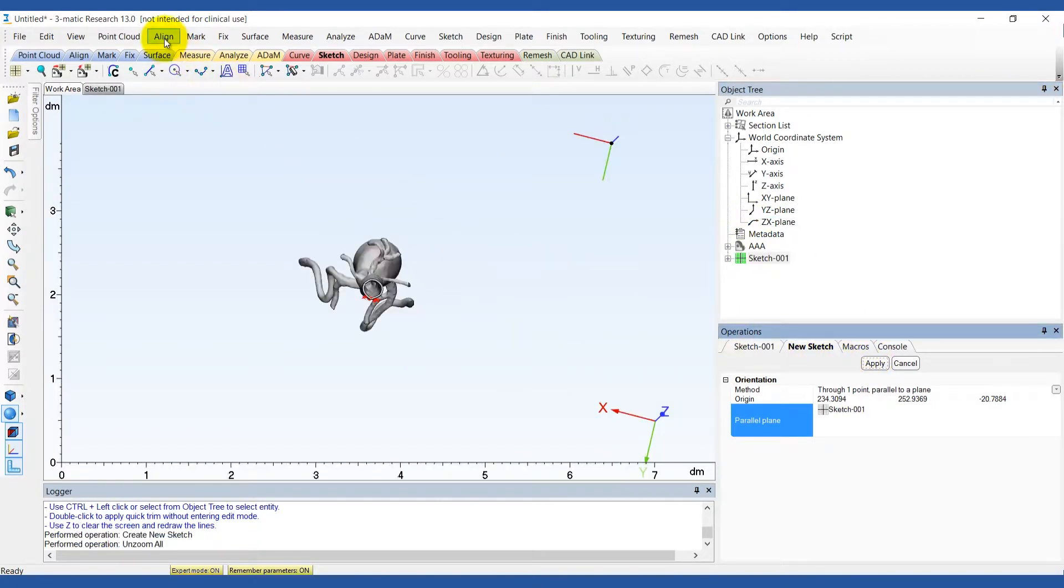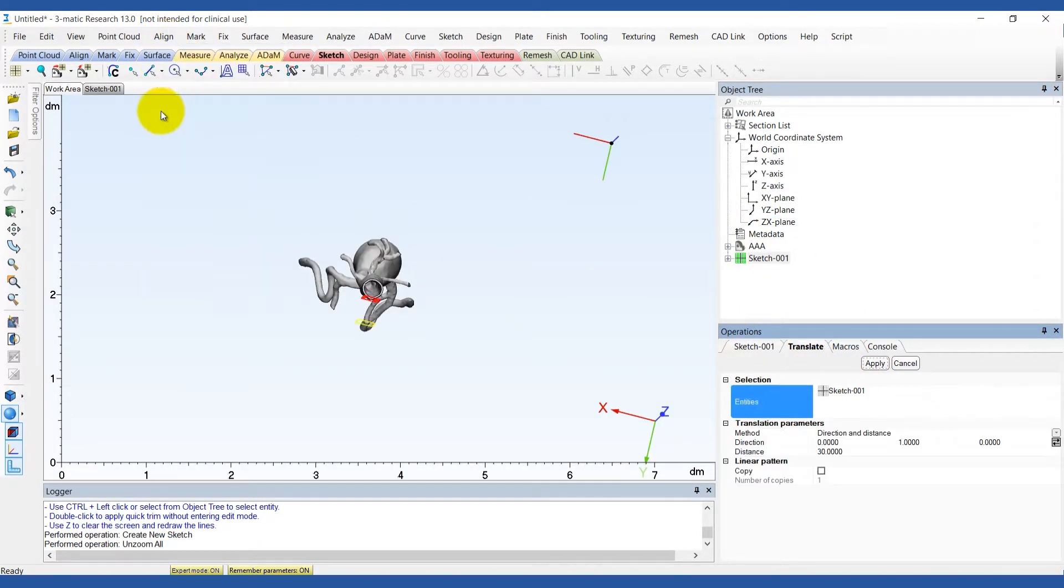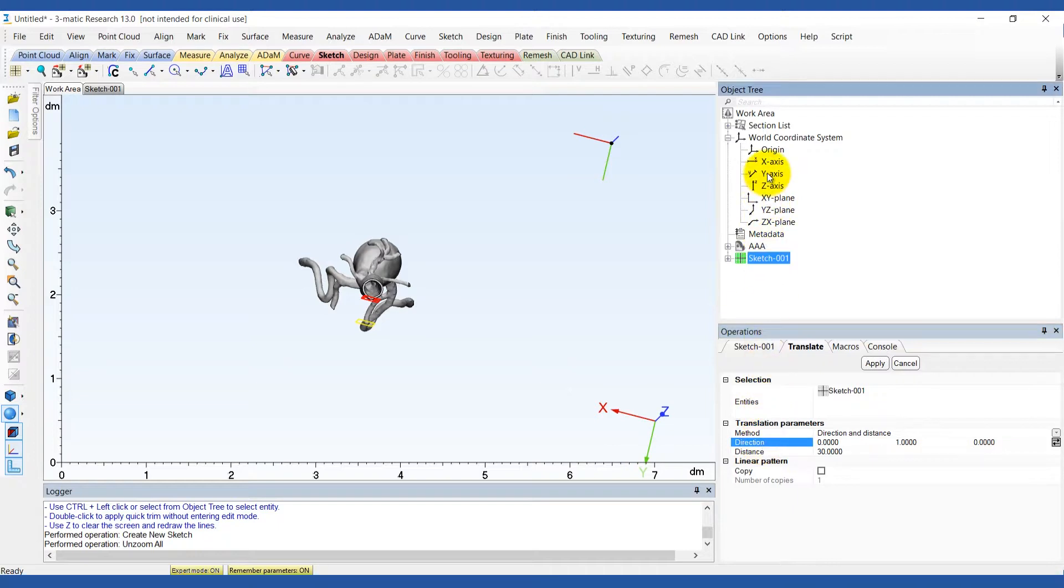Translate the sketch normal to the y-axis and move the sketch plane 30mm so that it doesn't intersect the anatomy at any point.